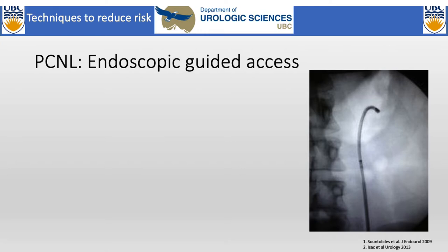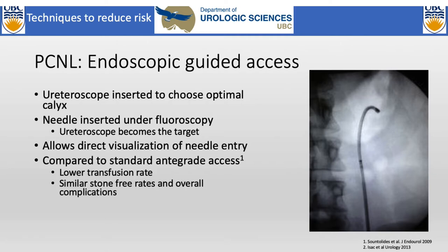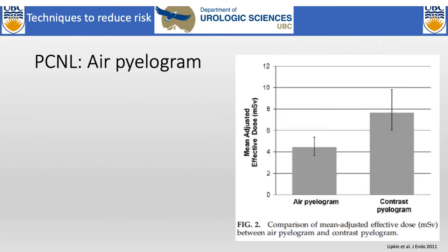Other options: put a scope up first and use the scope to help guide where you're putting your needle in. So, endoscopic guided access. Dr. McDougall, I know, used this quite a bit when she was at UC Irvine. This is their standard technique. It allows direct visualization, reduces your fluoroscopy, and overall, you get similar outcomes to going in with direct fluoroscopy.